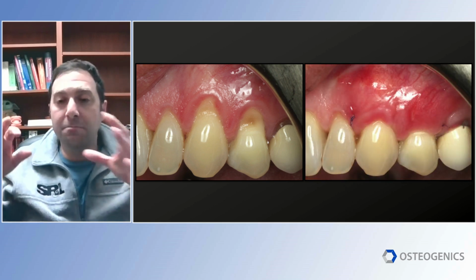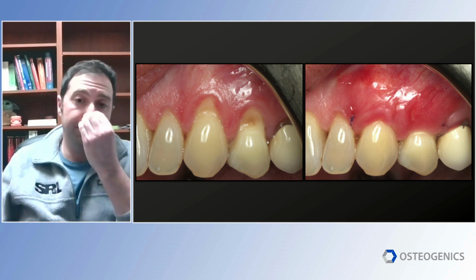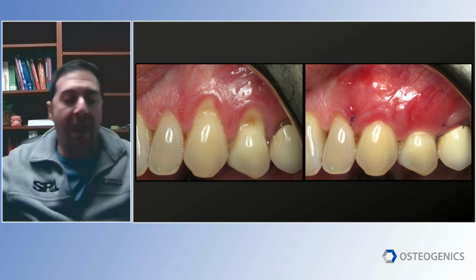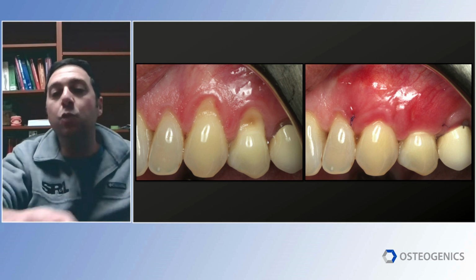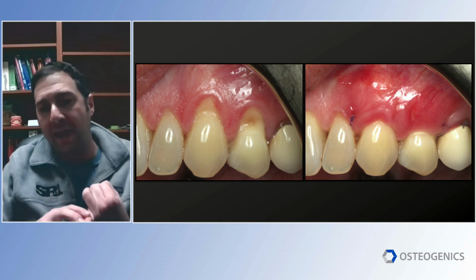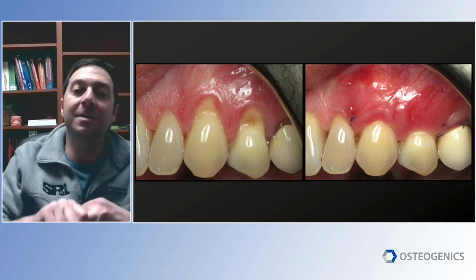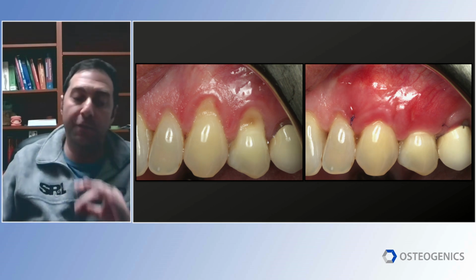And this is where microderm shines. This is the 2-week post-op, okay? When people ask me why do you use microderm now rather than other allografts, my answer is 2 weeks. This is why. The patient comes back at 2 weeks, almost no pain, minimal swelling, and the tissue looks amazing. And this is what I have found over and over again.